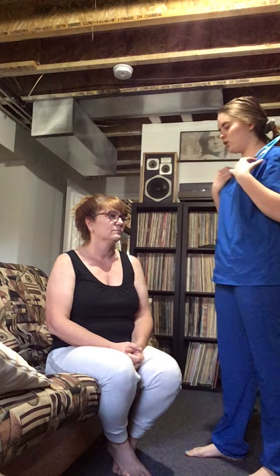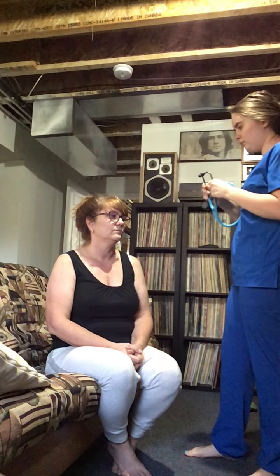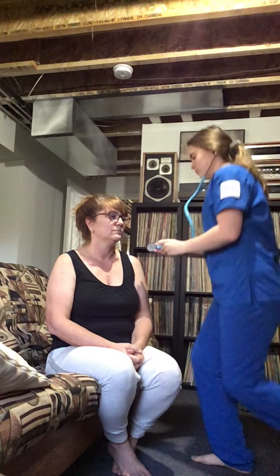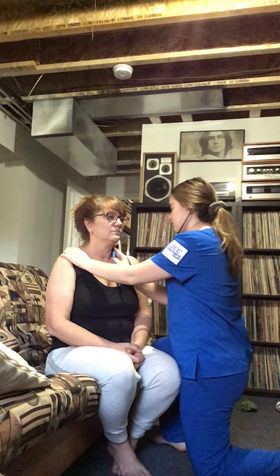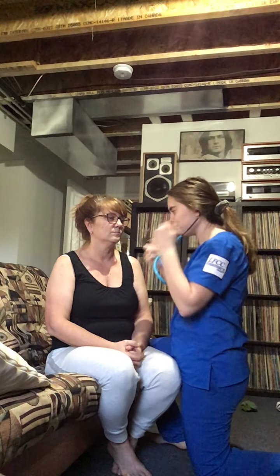Next, I'm going to listen to the carotid arteries. I'm going to use the diaphragm as well as the bell. I hear air moving in and out of the trachea, as well as a normal pulse. I don't hear any bruit or turbulent blood flow sounds. I'm going to do the same thing on the other side.